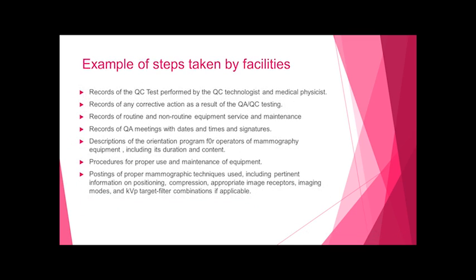So here are examples of facilities and the steps they've taken to stay within the law. Record QC tests performed by QC technologists, and the medical physicist says, okay, I checked the records and they're correct. Taking any corrective action as a result of the testing.